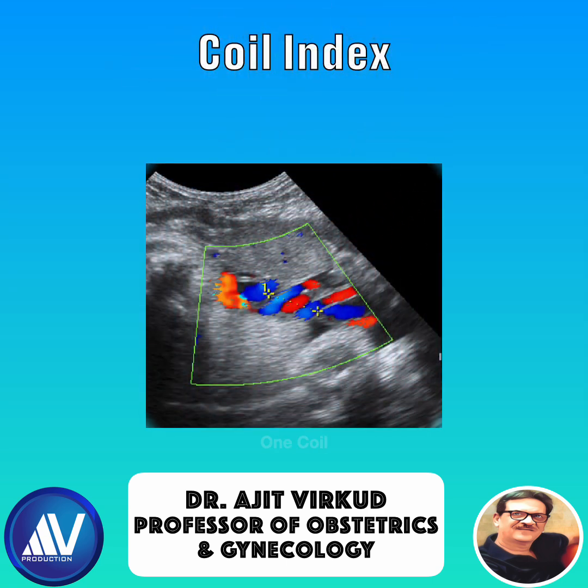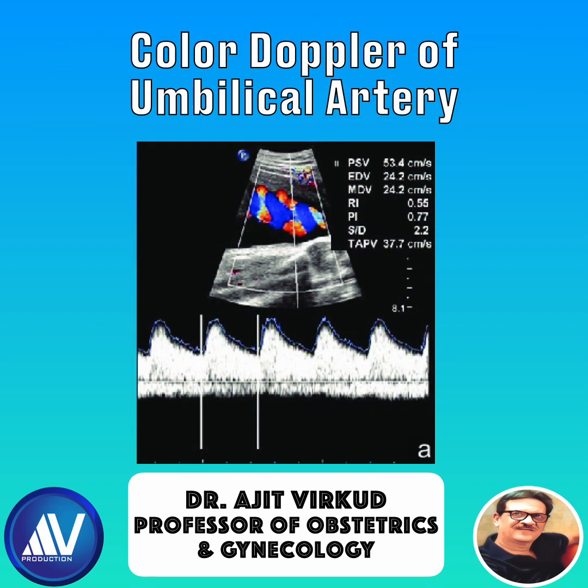The average coiling index is 0.2 coils per centimeter. Hypocoiled or hypercoiled cords may indicate fetal stress, but a normal cord pattern is physiologic and protective. Color Doppler of the umbilical arteries is very important for fetal health, especially for the diagnosis of fetal growth restriction.